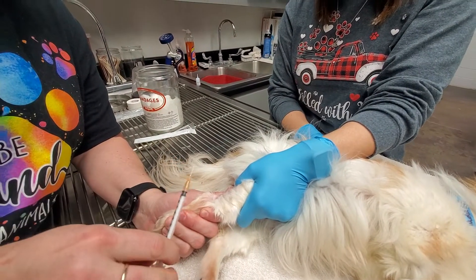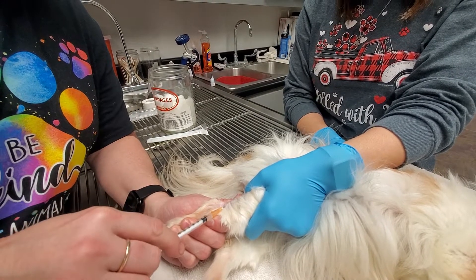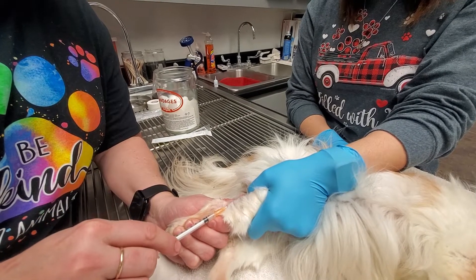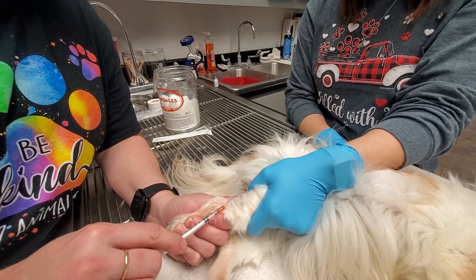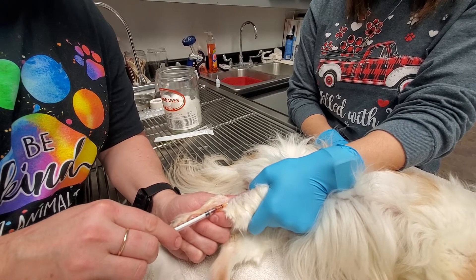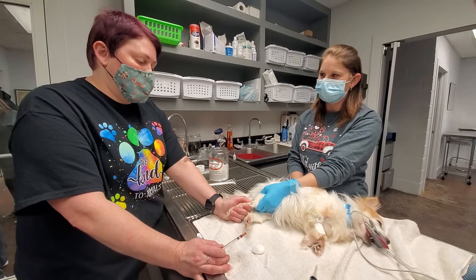Bevel up, two fingers on the syringe. And then hold the pressure so that she doesn't bleed.